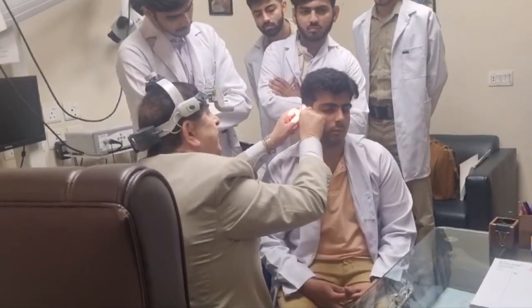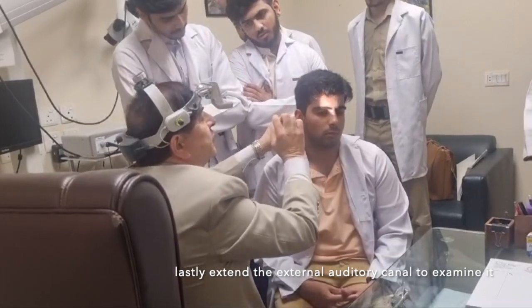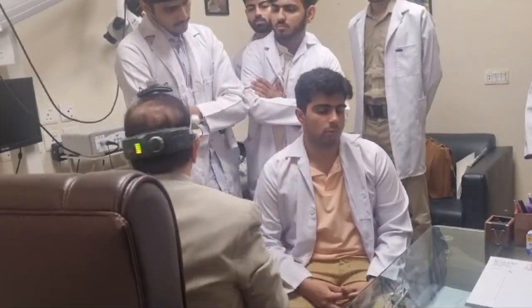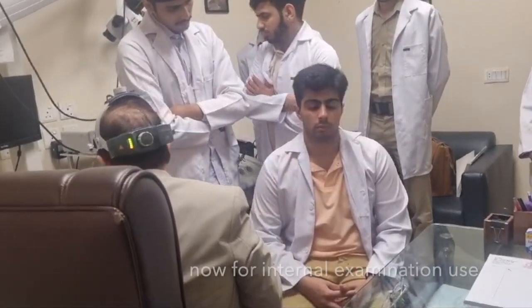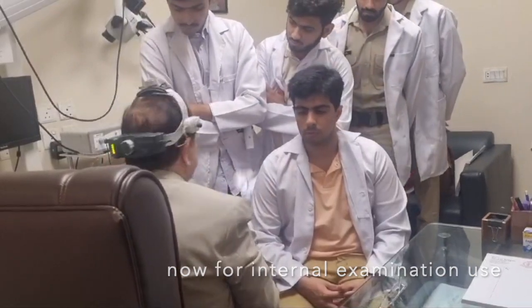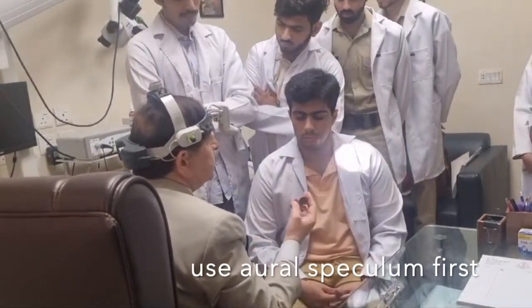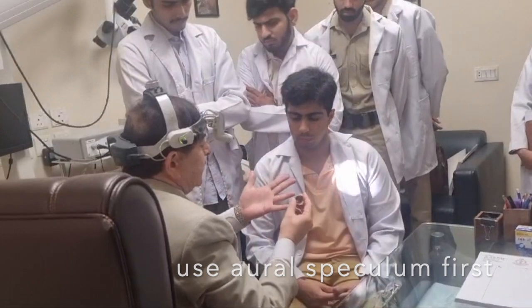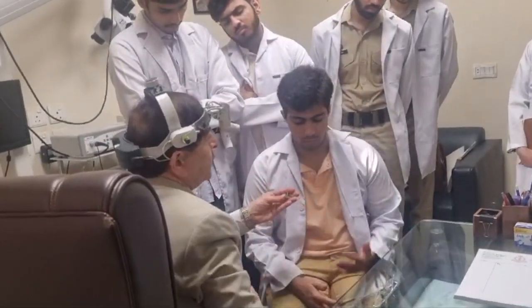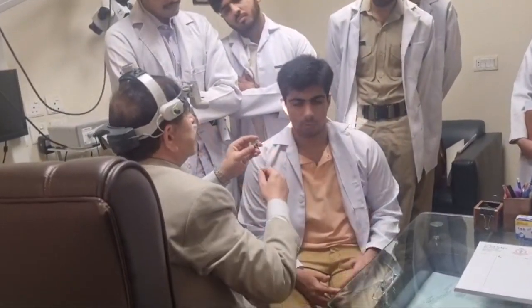Lastly, you want to extend and see the external auditory canal. Next comes the internal examination. I told you how to hold the speculum — between two fingers and then rotate with both hands.